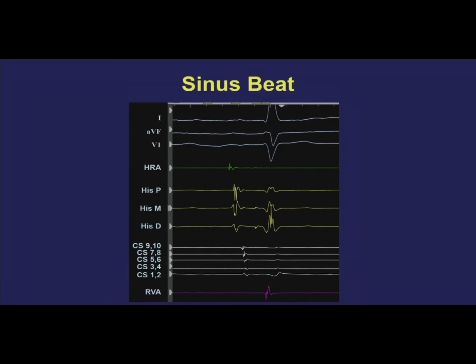Well, it's controversial. Nobody really knows. Josh will go over it tomorrow, but to get to something non-controversial, 2 questions. Why do you measure the earliest ventricular activation from the surface EKG? Why is it never measured from the intracardiacs?